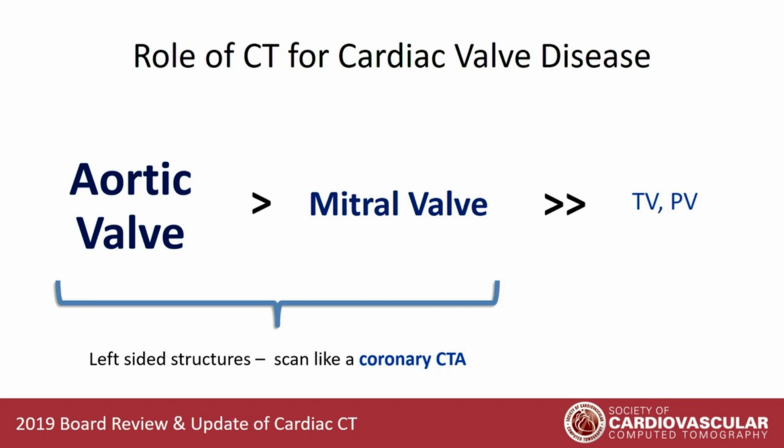You remember I put Chris Maroulis on the spot when he was here, where you're washing out the right side of the heart. We saw some cases yesterday where the right side of the heart was so washed out by saline that it was very difficult even to see the interventricular septum. If you don't opacify the right-sided cardiac chambers, you're going to have a really tough time evaluating the tricuspid valve, right? That's going to be a challenge.